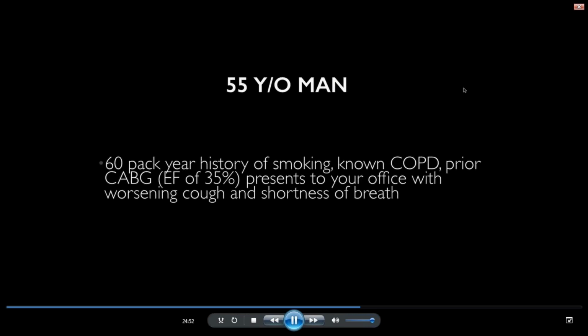Now remember that lung is at a cornerstone and intersection of ventilation and circulation, and it can give us a lot of helpful information. The downside, though, is that traditional physical exam is not very helpful when we are trying to make these diagnoses.